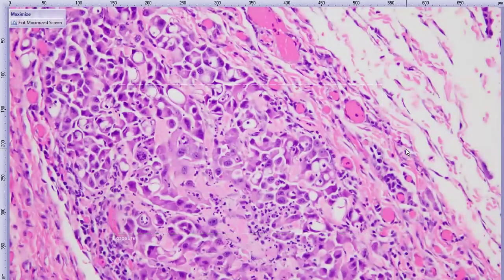So this is a neoplasm that has a fairly high degree of pleomorphism. As we were looking around, you probably spotted a good number of mitotic figures. There were a few. I can actually give you a specific number: there were 23 in 10 high magnification fields.